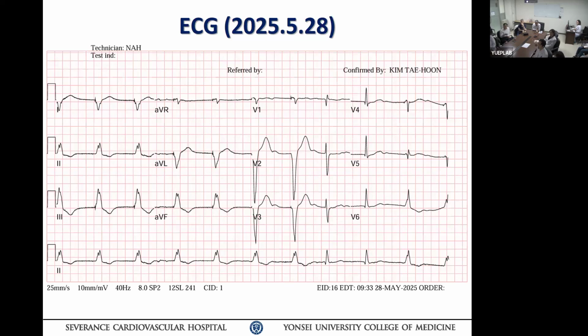So during the training for fellows, they often forget to get a 12-lead ECG in clinic. It is important, unless you're monitoring real-time ECG telemetry all the time while you're doing this. So you have two options. One is to display a 12-lead ECG, maybe 3 leads or so, or after programming, get a 12-lead EKG and confirm what you have done. It's very much essential. Now, anything else happening here?